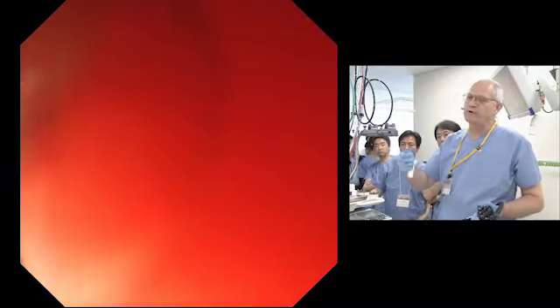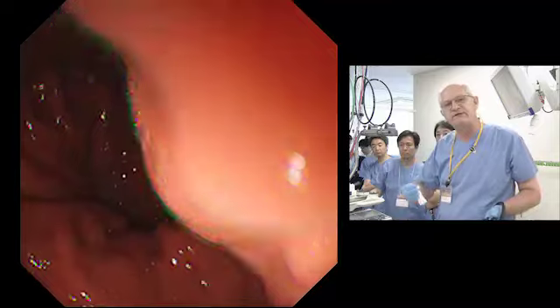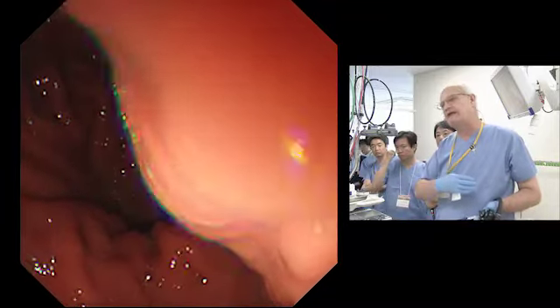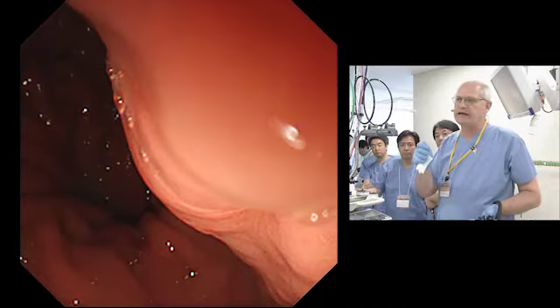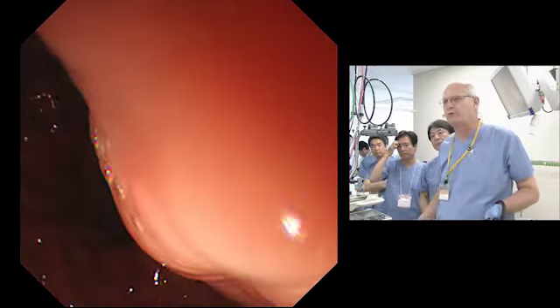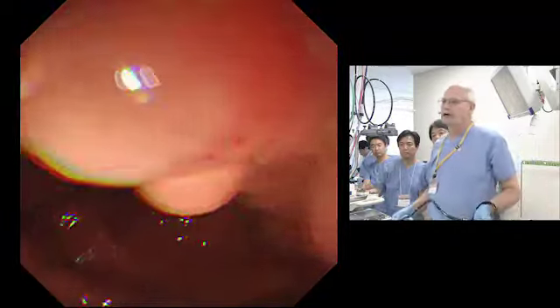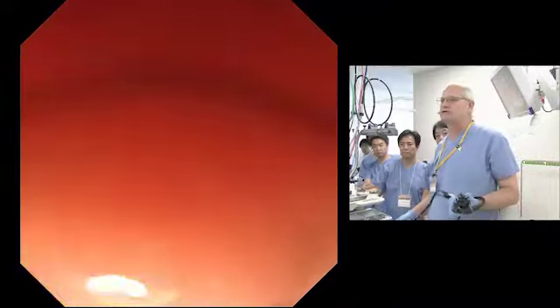It is important for me when I demonstrate EUS that everybody in the audience understands a systematic approach to imaging. This is my most important role here, I think. So you can see on the endoscopic view that I'm starting at the GE junction.